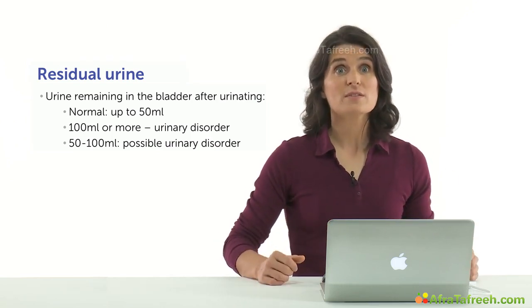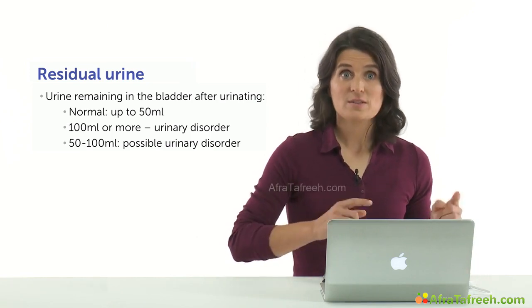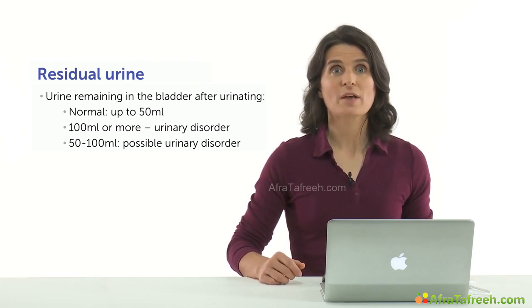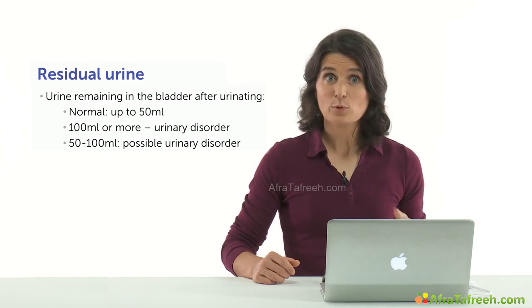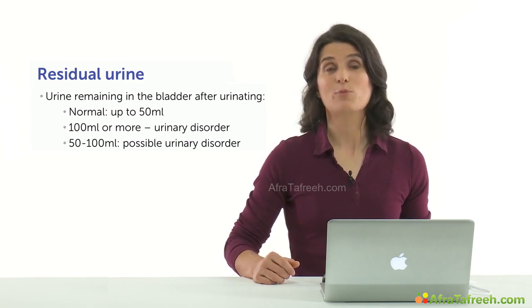Further observation is indicated. Important for this examination is that the patient has urinated shortly before the scan. Sometimes in clinical routine the patients have to wait for some time, and when they drink in the meantime there's the possibility of newly produced urine already. So it is helpful to ask your patient if he or she has urinated shortly before the examination. The next chapter will be tumors of the urinary bladder.